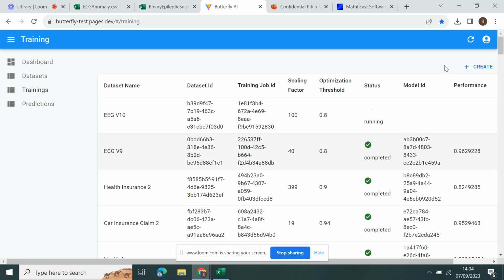Now, I think this is running right now. We're going to see when it's going to end. Let me see if it's completed already. Okay, we have the results.